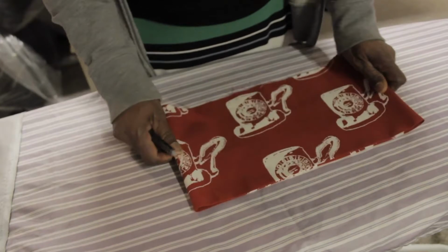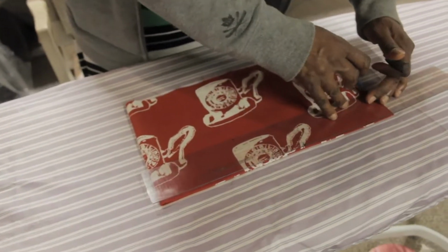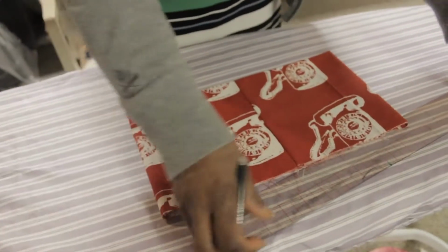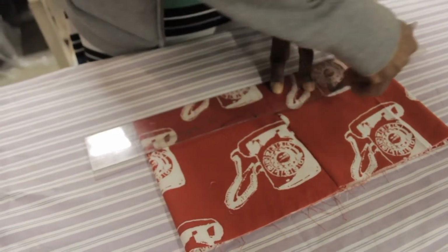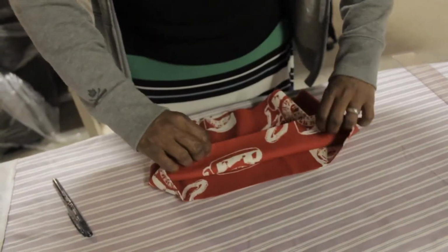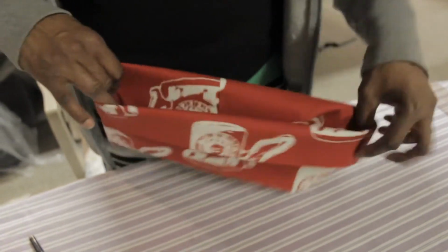Okay, so the next thing we're going to do is make a 2-inch cuff on this. So I'm going to mark my 2 inches on both sides here. I happen to have this ruler, a dressmaker's ruler, and it is exactly 2 inches wide, so I can use that. So I am now folding along that 2-inch line that I made. I'm going to make that 2-inch cuff.